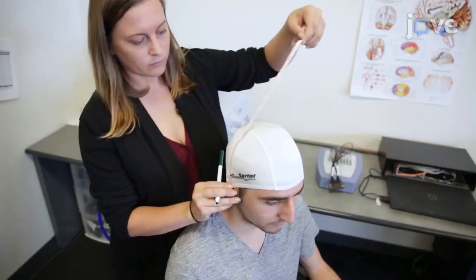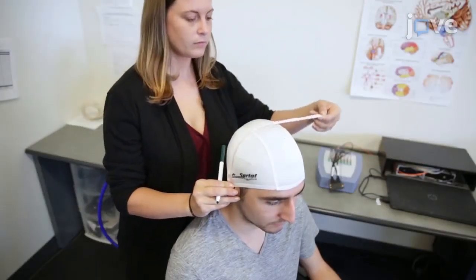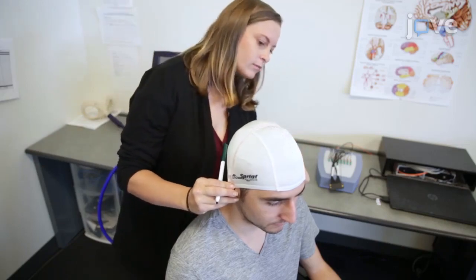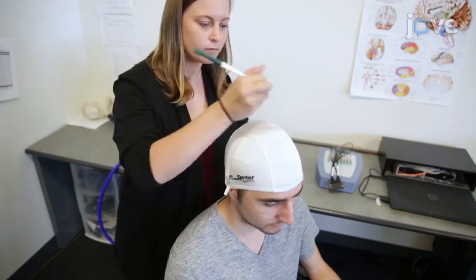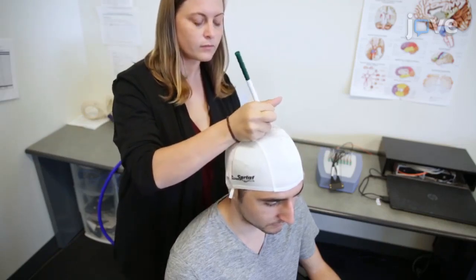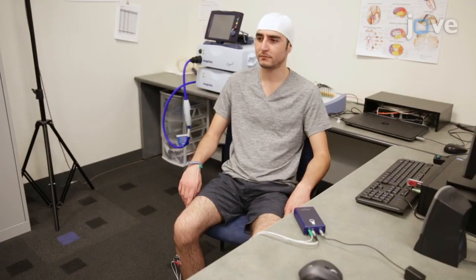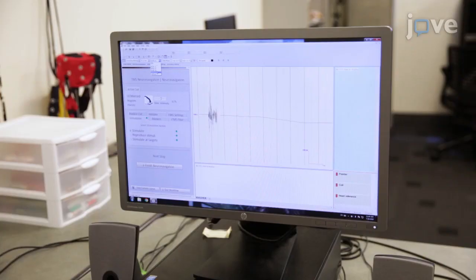Next, on the swim cap, measure and mark the center location, CZ, on the participant's head. Have the participant sit comfortably and begin recording the EMG electrode output to software that will filter and display the signal.